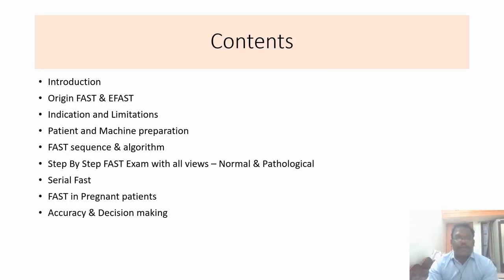In this class we are going to see some slides on the origin of FAST and EFAST, indications and limitations of EFAST, the patient and machine preparation, the EFAST algorithm, and how to do the EFAST assessment step by step, and there are some notes on serial FAST and the importance of doing FAST in pregnant patients.